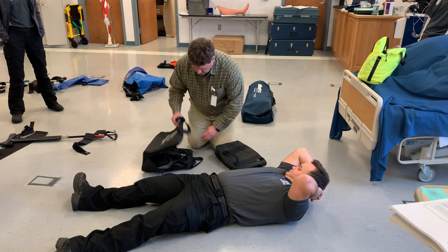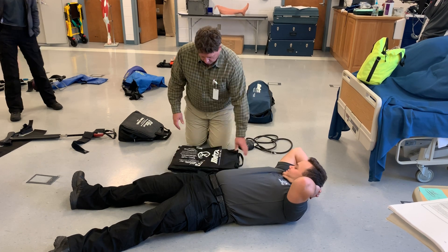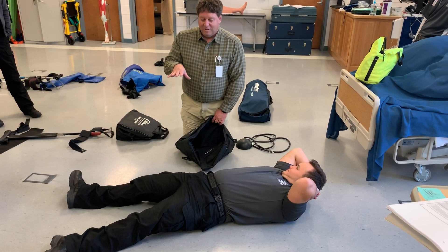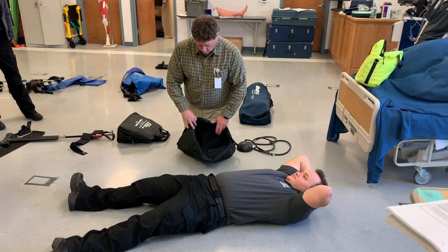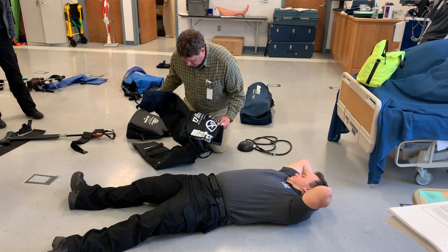The equipment consists of a lot of tubing, a little foot pump, and the garment itself. Of course you'd want to remove everything from the patient because it's going to apply a lot of pressure. Outside of class, with real patients, hats, socks, shoes — all that would come off. Which is okay because we're about to cover them back up with the trousers.